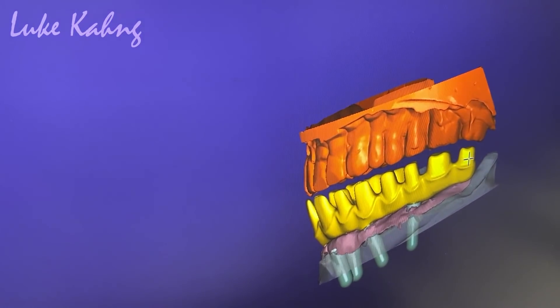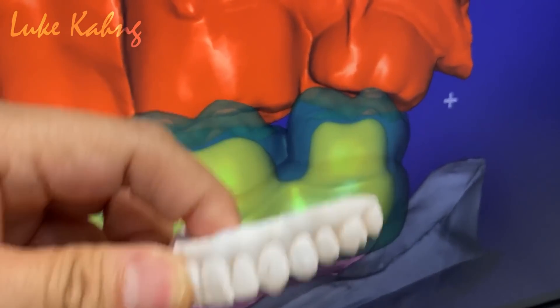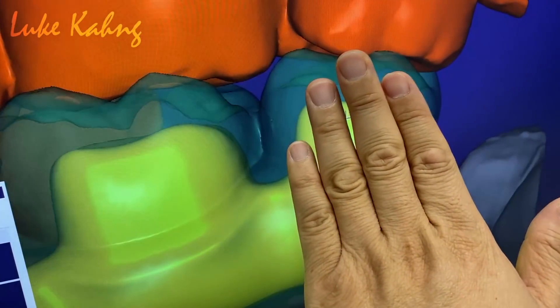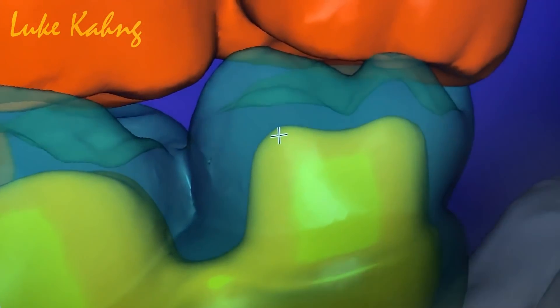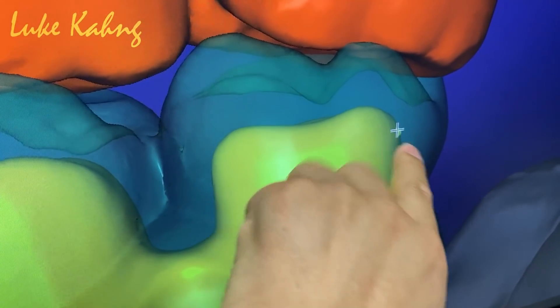Same thing here. Can you show me what they made on this one? Alright, the half side looks great. Now move this — make it like this — mesial contour. Bring more mesial. That's good.